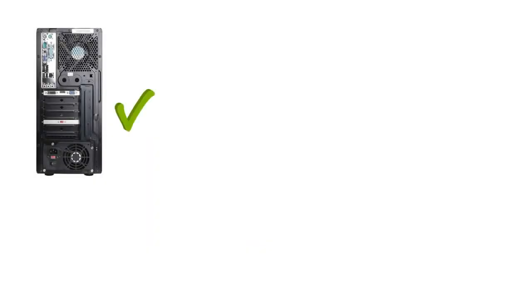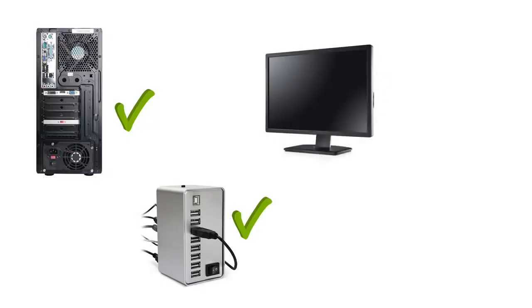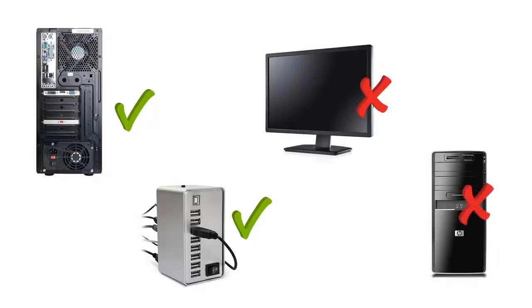RVG sensors have a direct-to-USB cable. The USB cable is 2.0 standard, but can also be used with the USB 3.0 ports found on newer computers. It is important to use the USB ports on the back of the PC tower or a powered USB hub in conjunction with the RVG sensors to ensure signal data transfer quality. Do not plug the RVG sensor or the USB hub into a USB port on the monitor or the USB ports on the front of the PC tower.